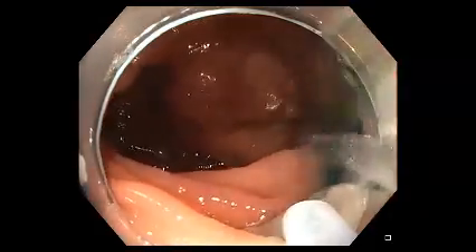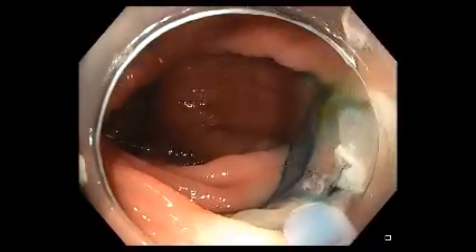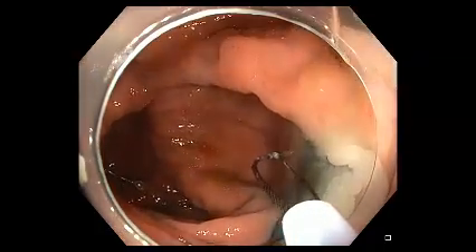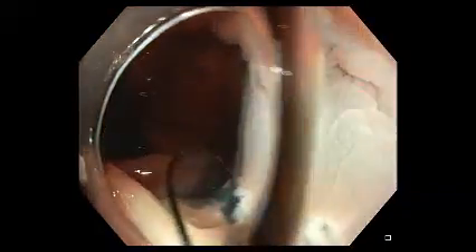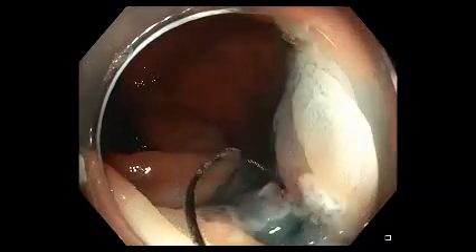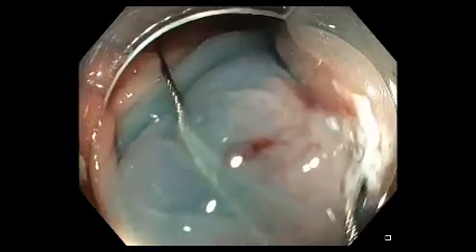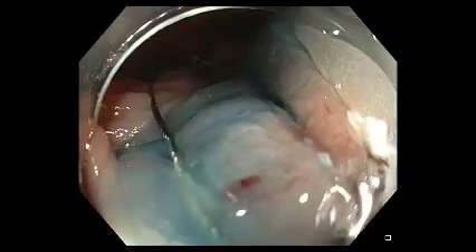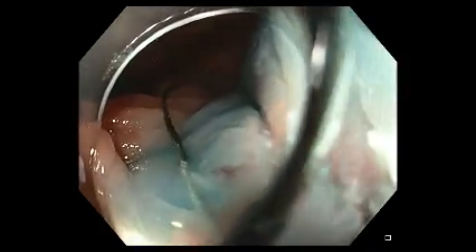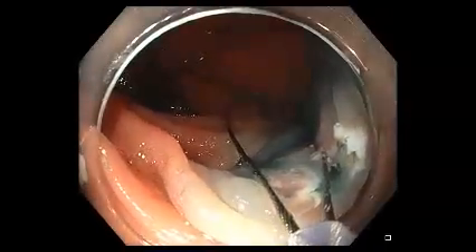When placing the wire for the adjacent tissue, it's important to ensure that the wire is placed in the same submucosal plane to ensure a contiguous resection with no residual tissue in between the different resection sites. You can see here the wire placed just at the base of the original resection and extending outwards with the wire grabbing through the same submucosal plane.